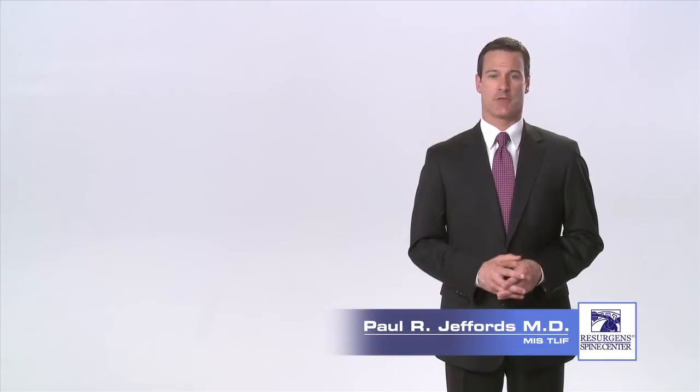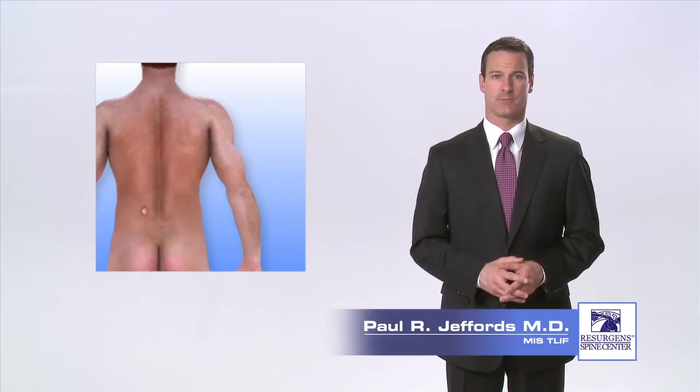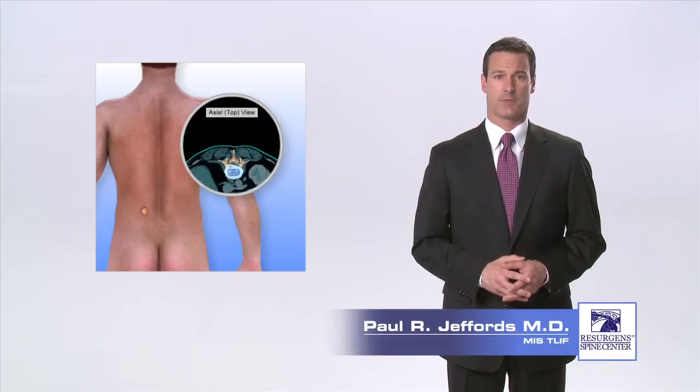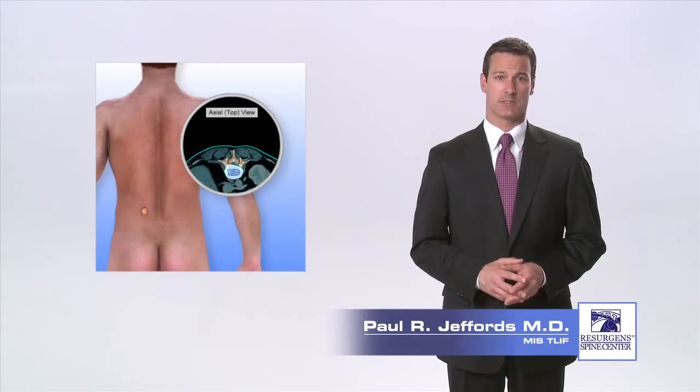Once you have been positioned on the operating room table face down, your surgeon will make a single small incision in your lower back about three to four inches from the middle of your spine. For a single level fusion, the incision is typically one inch in length. An x-ray machine called a fluoroscope is used to image the spine and pinpoint exactly where to place the incision.